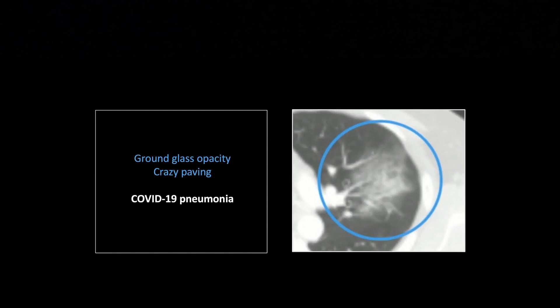When it gets worse, it will range into frank consolidation and get pretty nonspecific in its appearance. But early on, this is a great way to catch it. It will typically be bilateral, rounded, and peripheral and demonstrate a combination of ground glass and crazy paving.